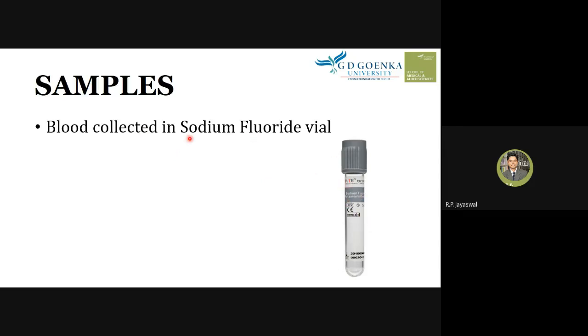So blood should be collected in a sodium fluoride vial. Okay, you have to remember this. Why should blood be collected in a sodium fluoride vial? Because sodium fluoride basically inhibits glycolysis. It preserves the glucose in the sample.